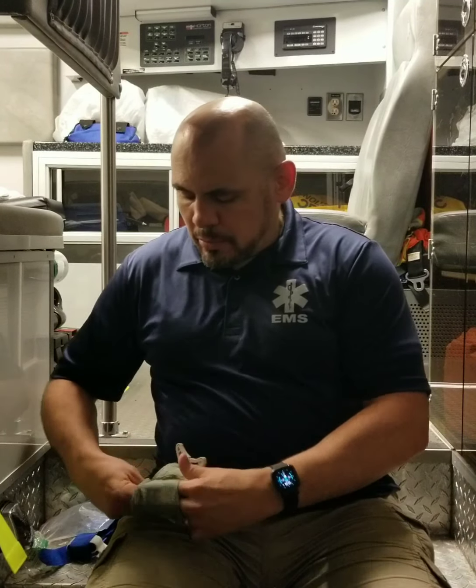Put it over the wound. You want to try to bring it around where this clip here, this loop, is going to be on the wound. So let's just say it's on top of my forearm. I want to put it there, wrap it around. I'm going to feed it through. And then I want to, again, put pressure. And again, you just keep wrapping it. It's got a couple of clips here that you could just hook it and it would isolate it. And again, the idea is to get to the hospital.